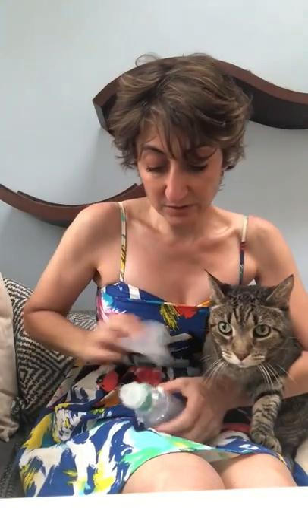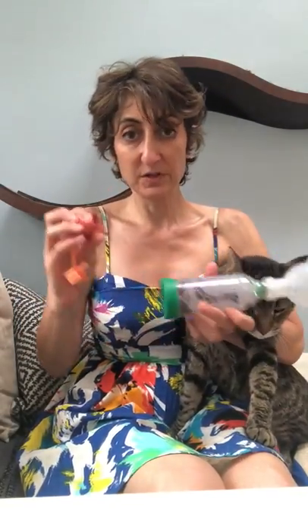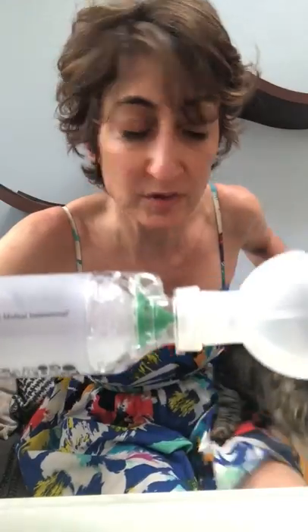What you do is just like you would with a normal inhaler if you're a human — you're going to take it and shake it a few times. Then instead of shooting it straight into their face, you're going to put it in here. It just fits back here. One tip I'll give you is, see that part in the front where there's a little bit of a hump there.